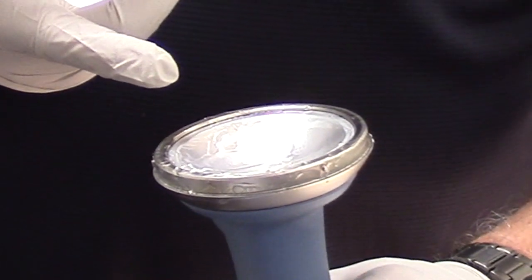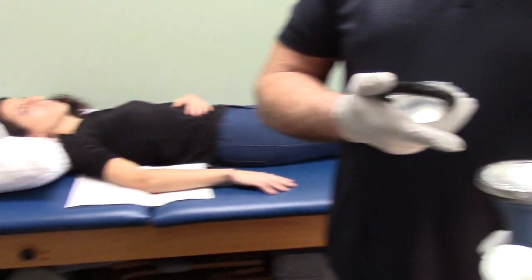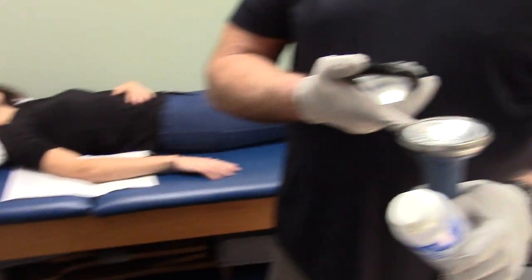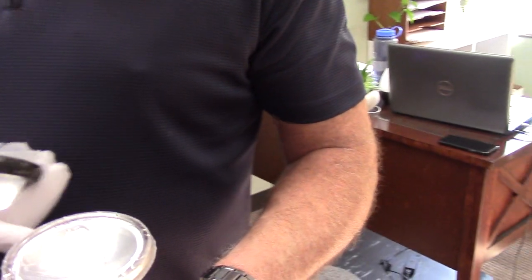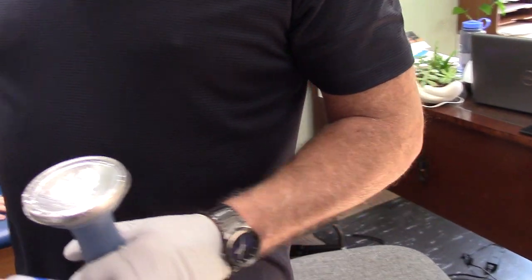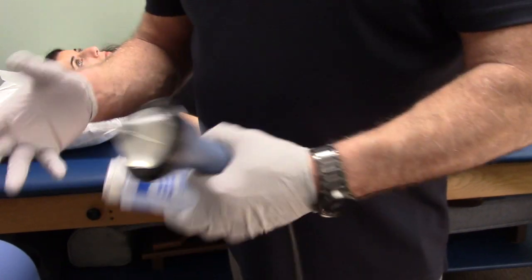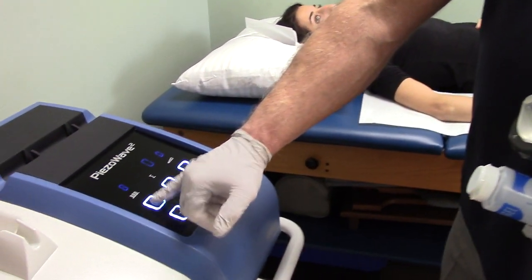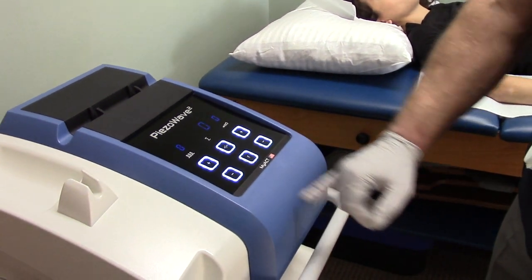On this particular unit, the Piezowave 2, with the direct applicator I'm going to be using, the sound pulse is one centimeter cube — like a sugar cube type of thing. I can change the frequency. There are four factors I can change and modify. In her case, I use a maximum frequency of eight.